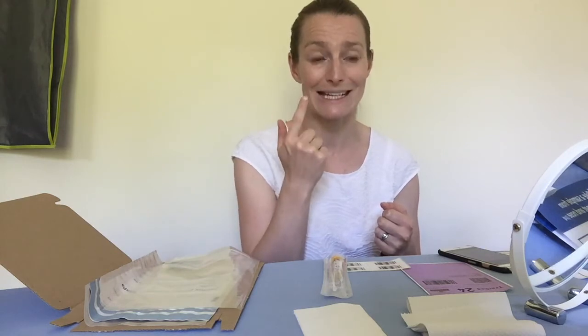The next thing you need to do is work out what you're going to swab. This swab is one swab but you put it in two places — in your mouth around the tonsil area and in your nose. So it's a throat and nasal swab. What it tells you to do is open your mouth really wide, have a look in a mirror and identify where your tonsils are.